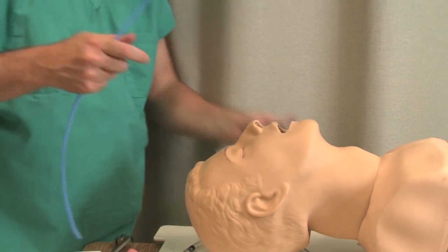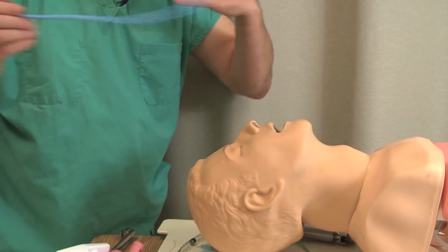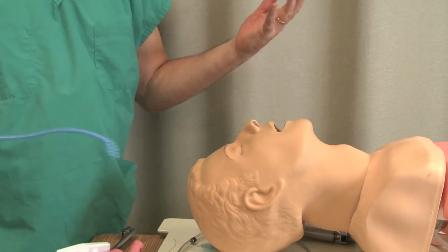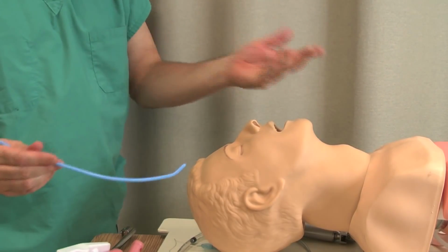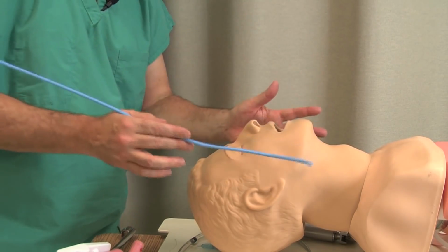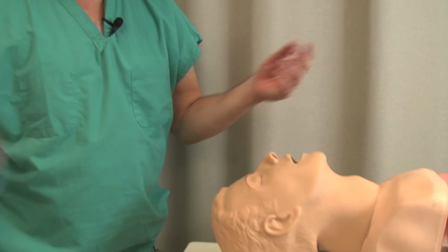I try to emphasize to people, especially when they're first learning, using the bougie is not a crutch. It's not a sign of weakness. If you need the bougie, use the bougie. The bougie's there for a reason. The day will come when maybe you don't need a bougie, but if you ever need it, I'd much rather have you use the bougie and have the endotracheal tube in than to not use the bougie and be turning to me and making a long explanation. So bougie, very, very handy device.